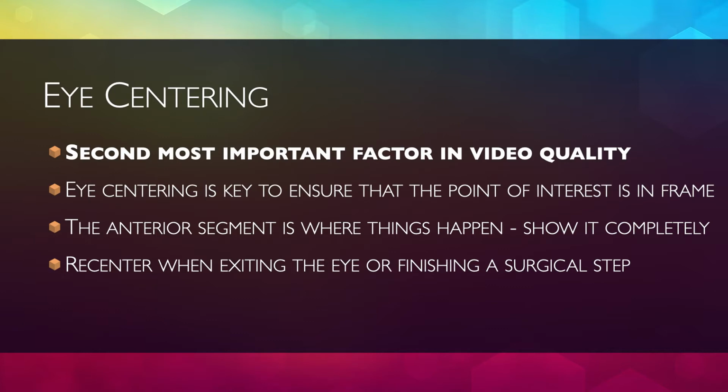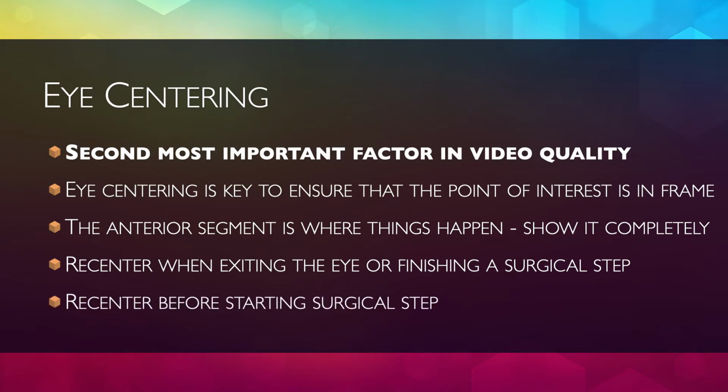Always recenter before or right after exiting the eye or finishing a surgical step, and recenter right before starting steps. It is common to have idle time between surgical steps, and when editing out segments, this makes for smoother transitions, avoiding annoying image jumping.